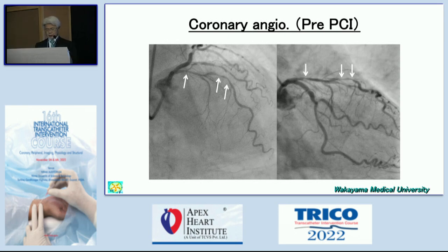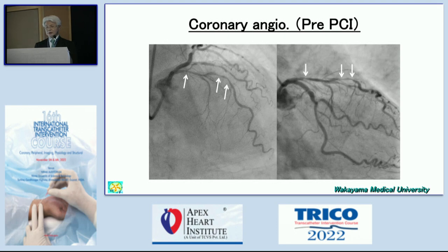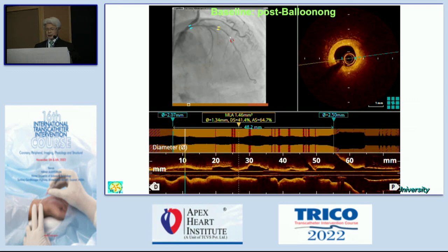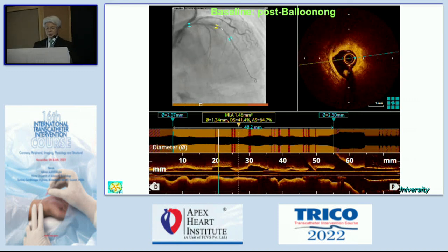In the case of a long diffuse region, you can identify from the proximal to the mid-LAD there are lots of disease over a very long segment. If you try to get a clear image by OCT, it is important to have enough diameter. If you push the OCT catheter under this condition, you cannot get a clear image. It is very important to do pre-dilatation using a 2.0 or 2.5 balloon. After that, you can get a clear image. This is a post-dilatation image.